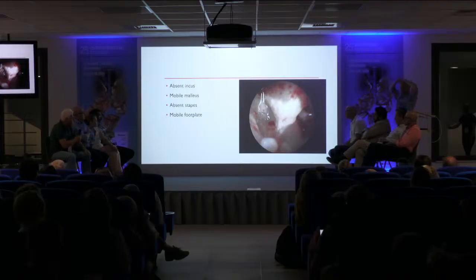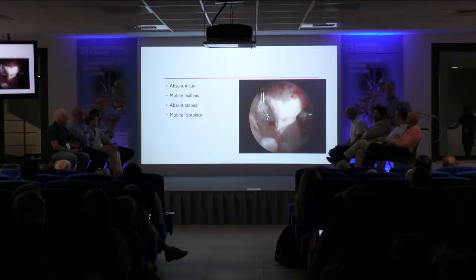Yeah, okay. So the problem with TORPs, I think I said in my talk, is the foot plate. And the Dornhoffer shoe gives you a very vertical assembly. And if it's aligned properly, it's really nice, but it's not always aligned properly. And then it actually pushes it in slightly the wrong direction. Does anybody have any good solution for stability at the foot plate? Any tricks? You must have a trick, Jose Carlos.